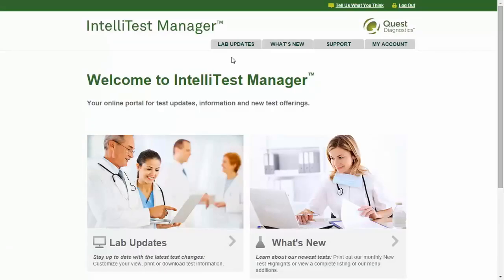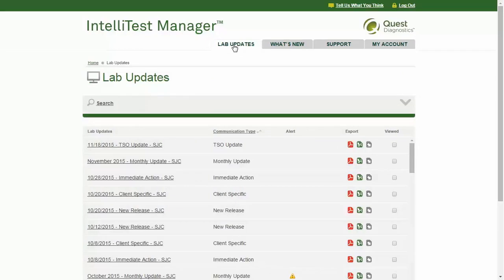The Lab Updates page lists all types of lab communications received within the past rolling 12 months. Communication types include monthly update, immediate action, new release, special announcement, client specific, or test send out. These communications are sorted by announcement date and title in the first column, with the most recent updates listed first.